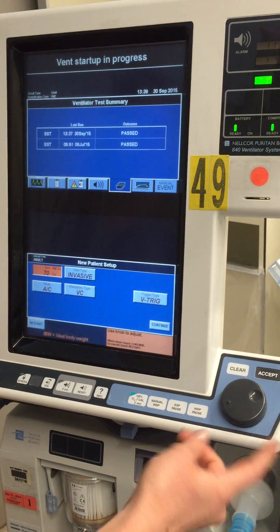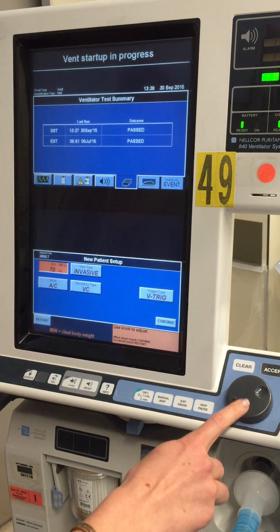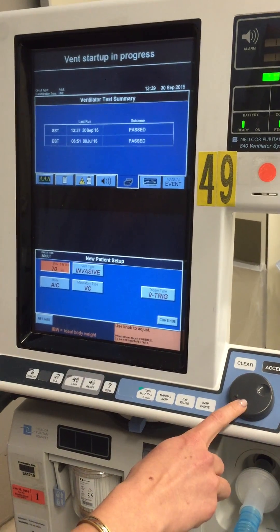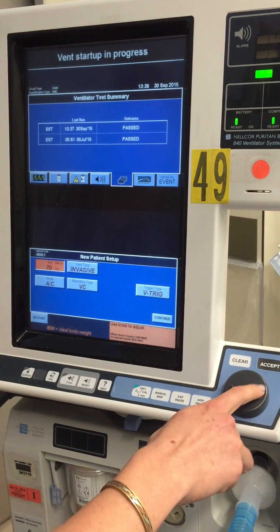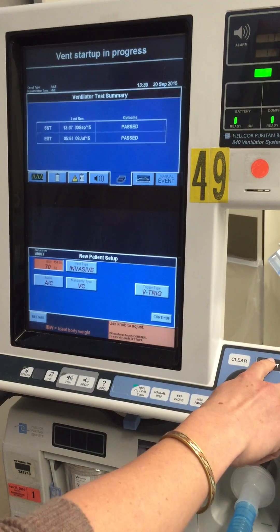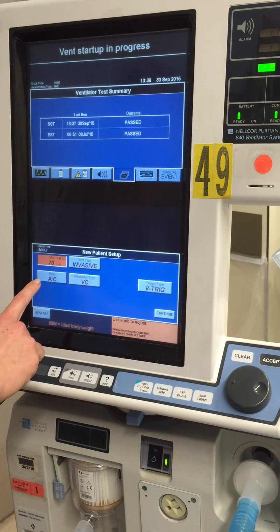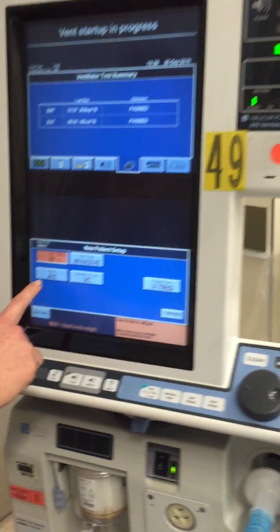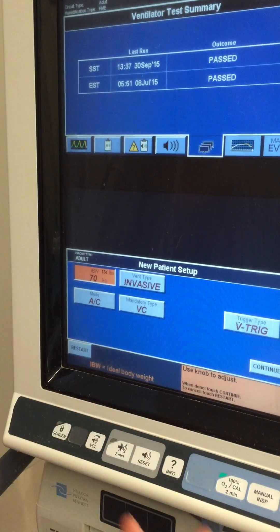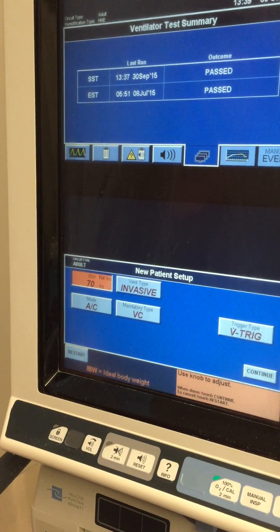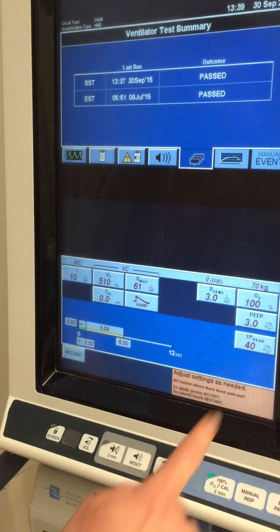It's not necessarily pertinent. You can use this little scroll button and press accept when you're ready. Our mode right now is ACVC, which we want to keep on volume control, so we'll just press continue.